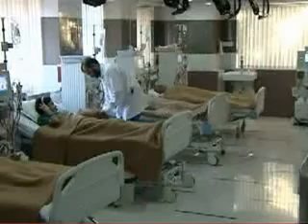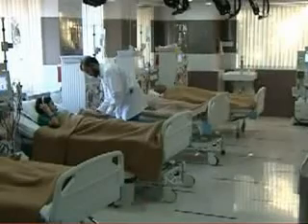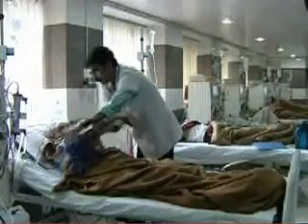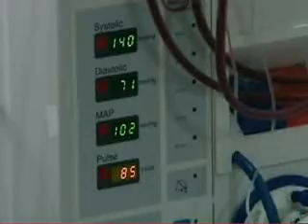When the patient comes to dialysis, the patient first takes a position. After taking the position, the patient is placed on the bed. They have to be comfortable with the bed. Then BP, pulse, and temperature are taken.